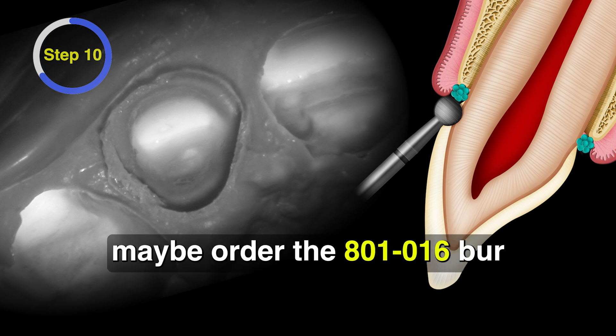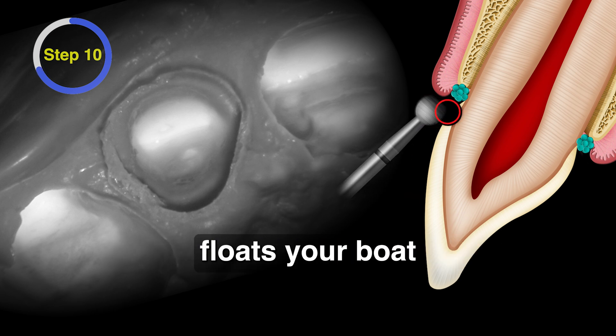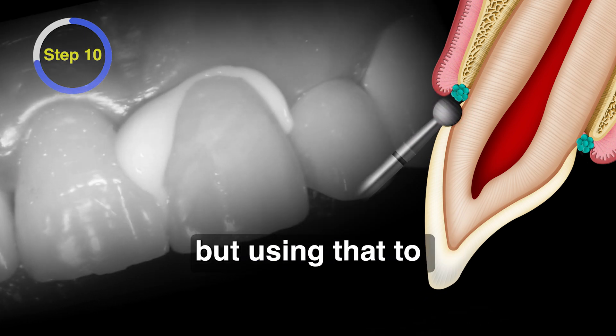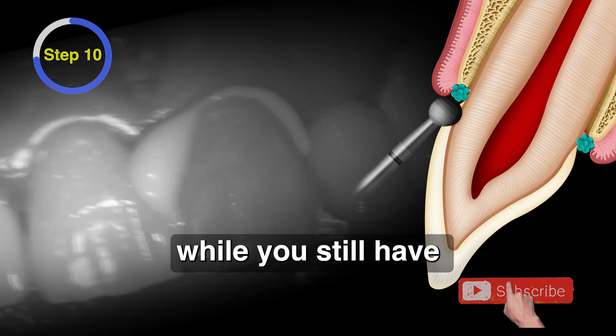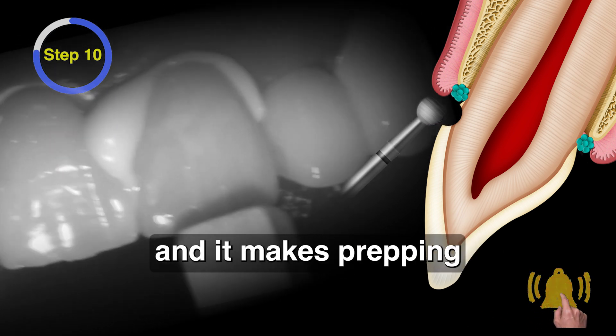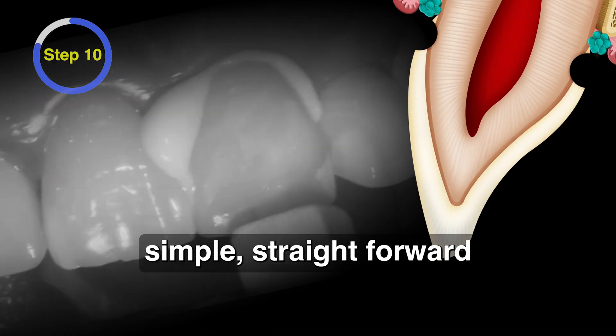I would encourage you to order some of those — maybe order the 016, the 014, the 018, whatever kind of floats your boat. We don't really need the 021 all that much. But using that burr to prep the gingival margins while you still have the rest of the hard tooth structure is kind of the magical part of this, and it makes prepping an almost perfect margin simple, straightforward, and predictable.